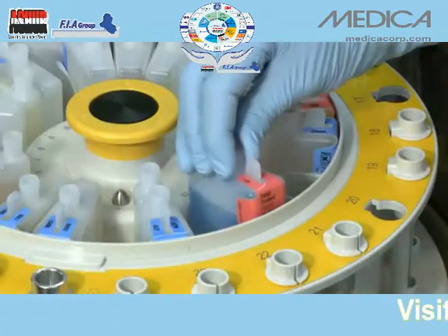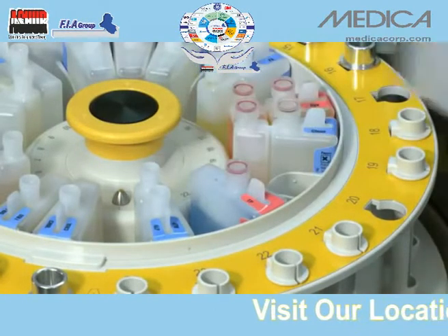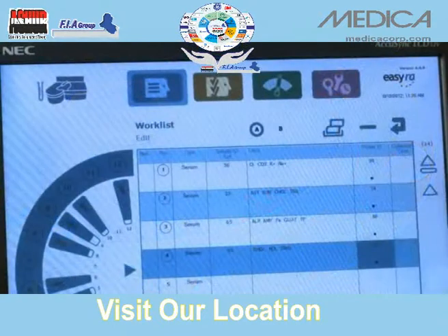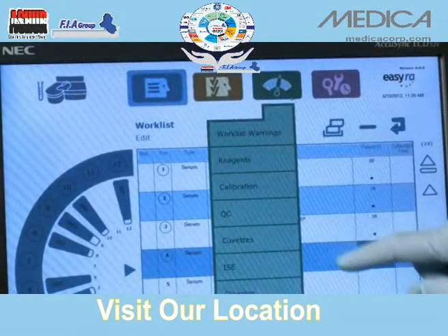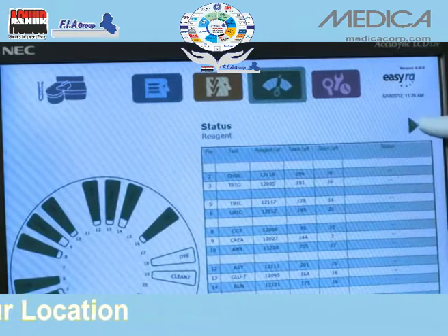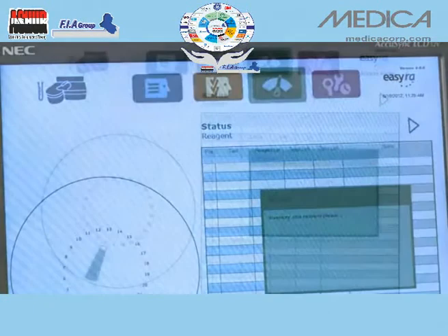There is never a need for manual programming. Simply place a smart reagent wedge on the analyzer, and EZRA identifies reagent locations, number of samples remaining, sample volumes, and expiration dates.